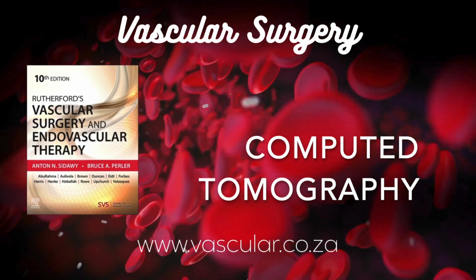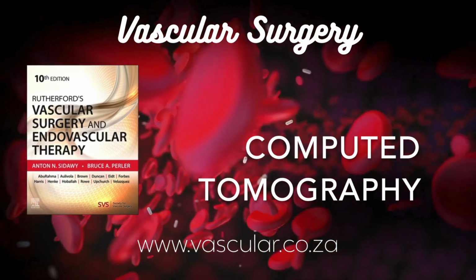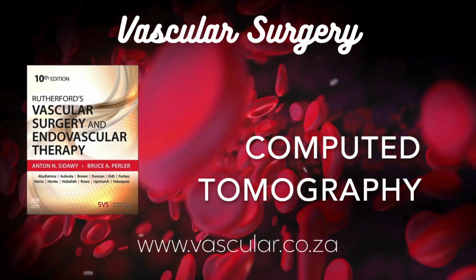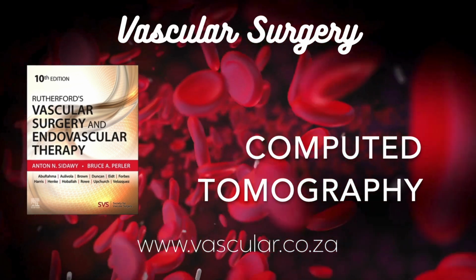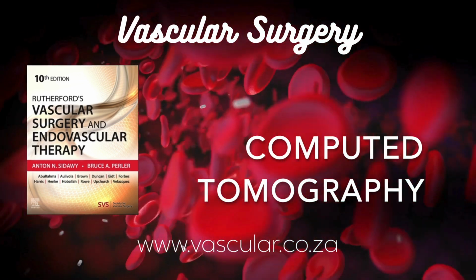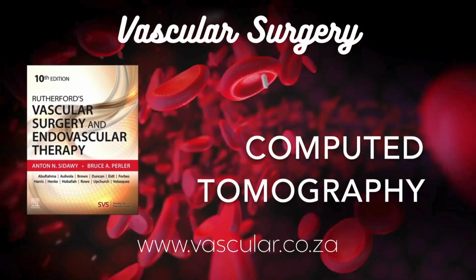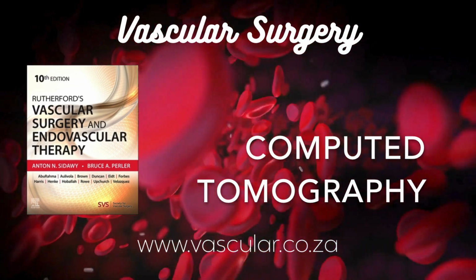We focused on arteries. Does CT play a role in vein problems? It can, yes. With the right timing for the contrast, a venous phase protocol, CT can diagnose things like blood clots in the abdominal veins, like mesenteric vein thrombosis. And CT pulmonary angiography, CTPA, has basically replaced older methods for diagnosing pulmonary emboli, clots in the lungs.